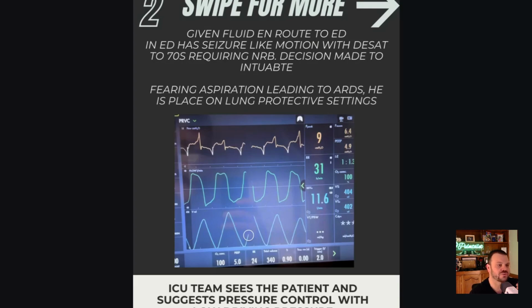And how do you do that? You do that by the time constant. Or at least that's how I do it, and I think that's the best way to do it. But for this patient, eventually they woke up and now they're participating in ventilation, obviously, because they're incredibly tachypneic. They're at a respiratory rate of 30, 31.